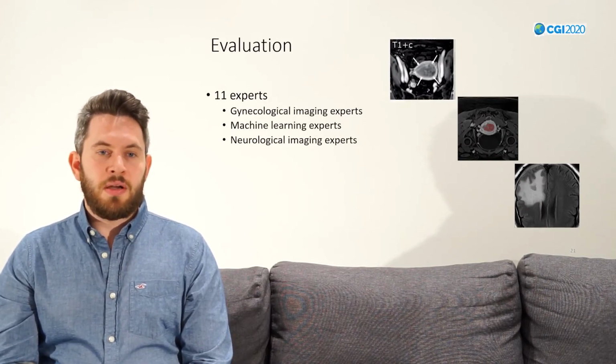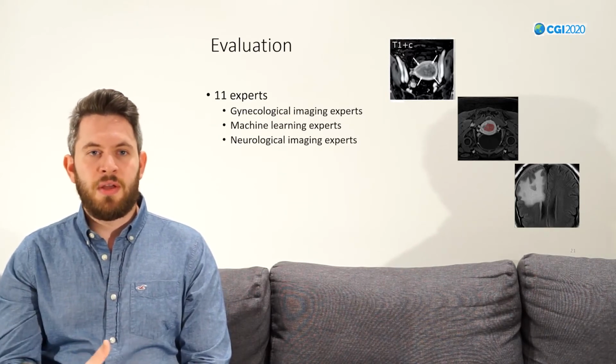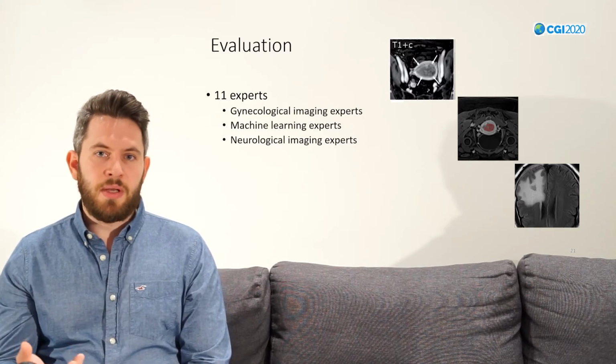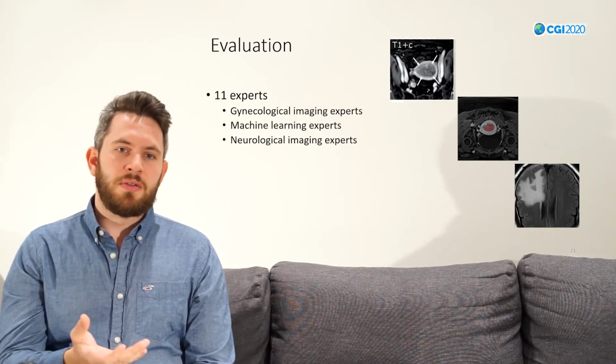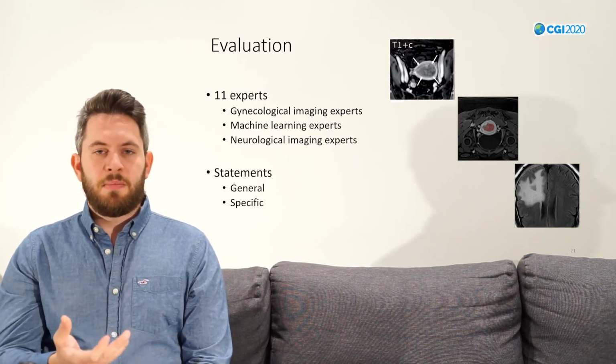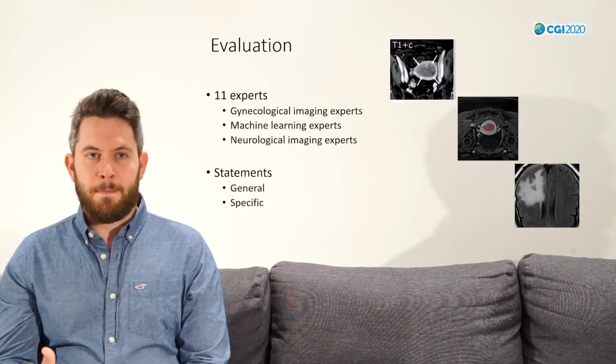So the evaluation started by presenting them the application and giving them a short introduction to it, and then afterwards they were able to explore the capabilities of our application, and afterwards they could give us feedback in general and more specific statements, how useful they find the application and what was difficult for them.